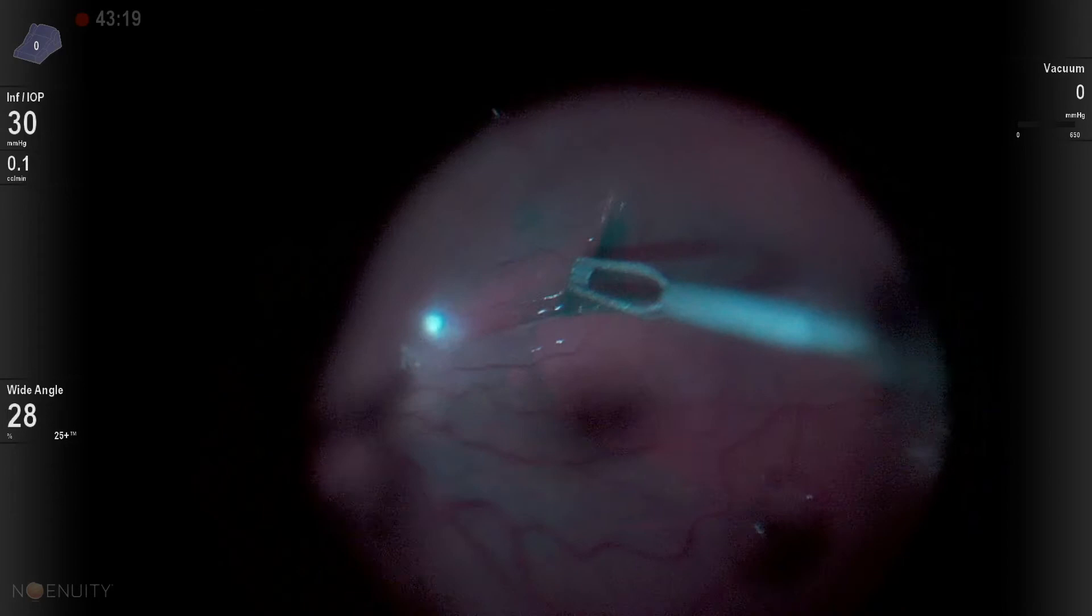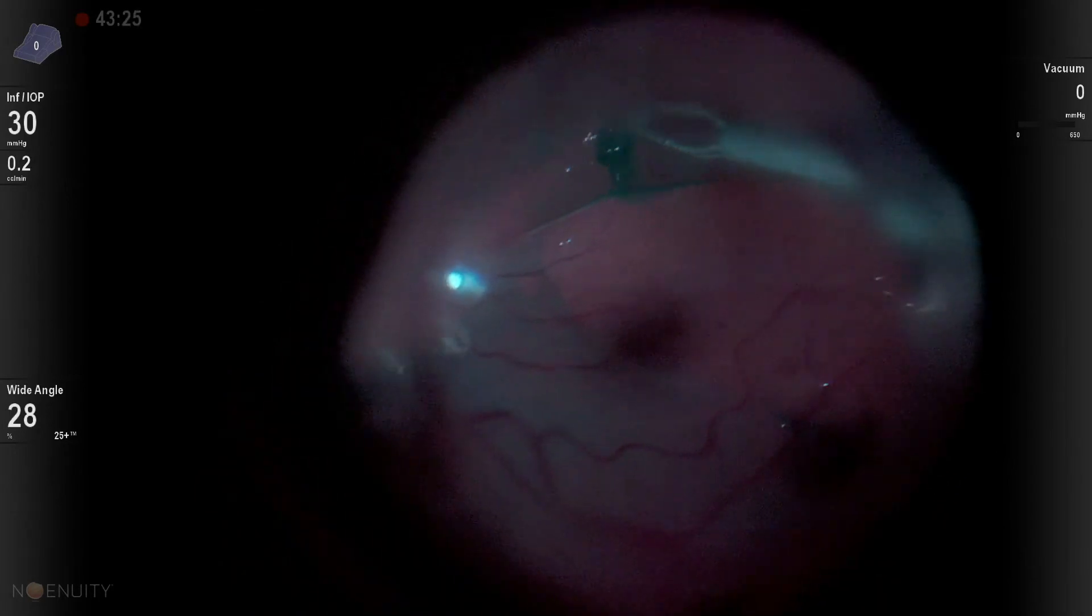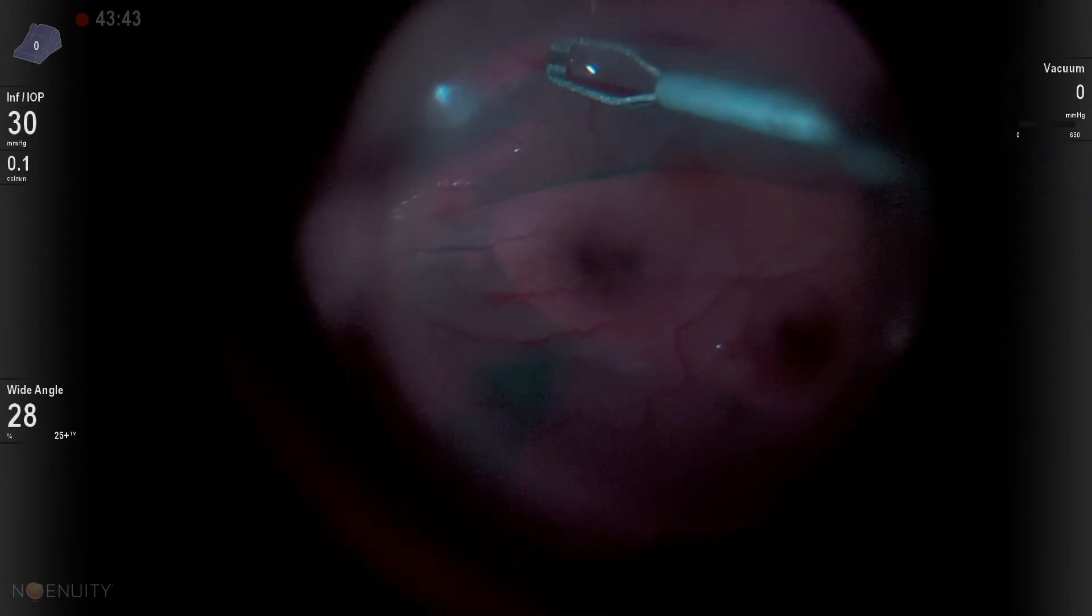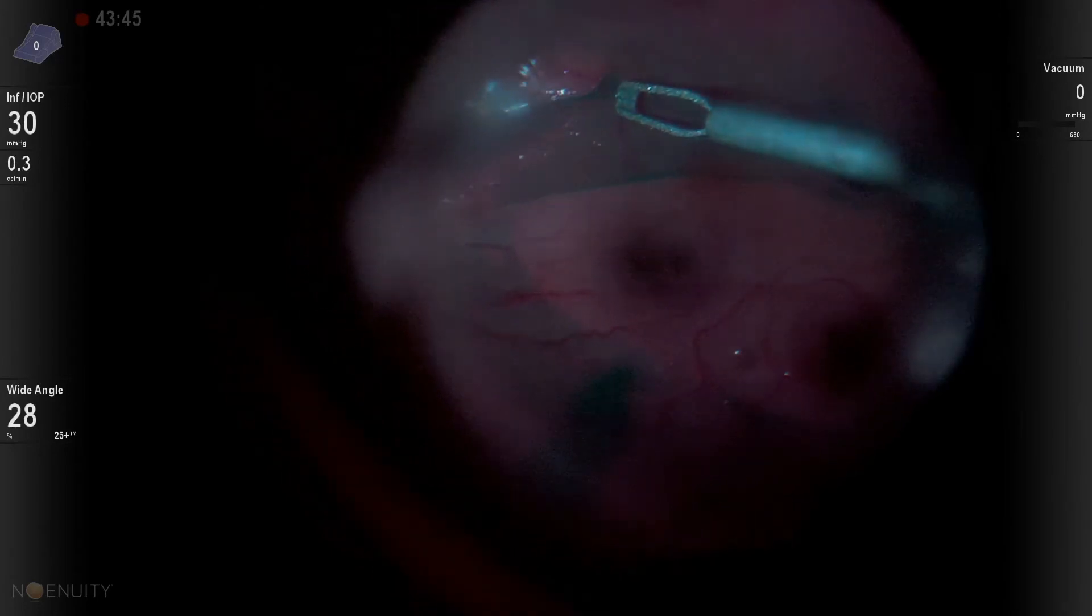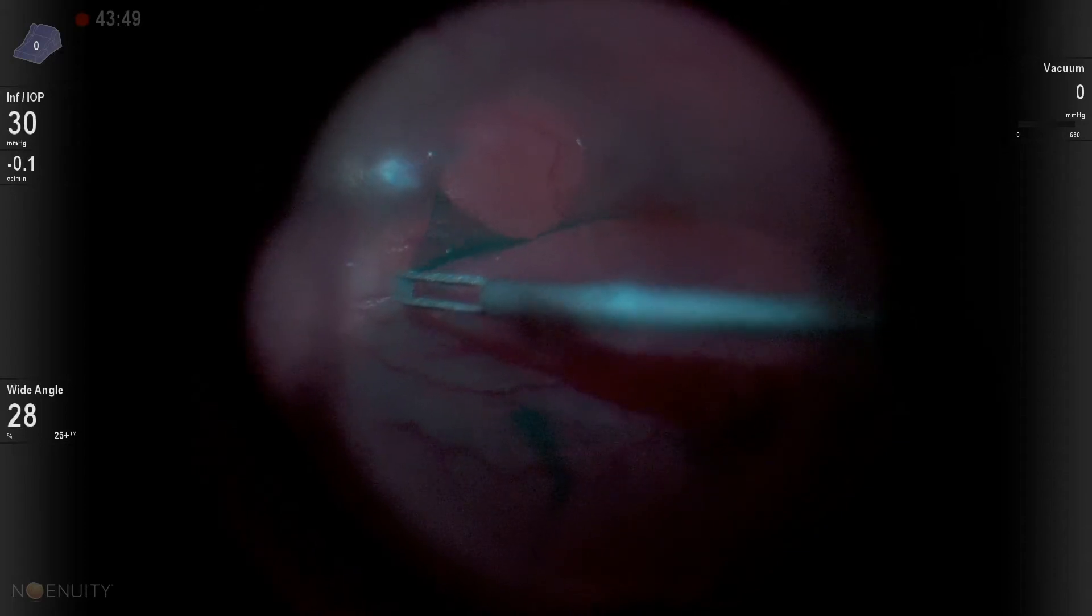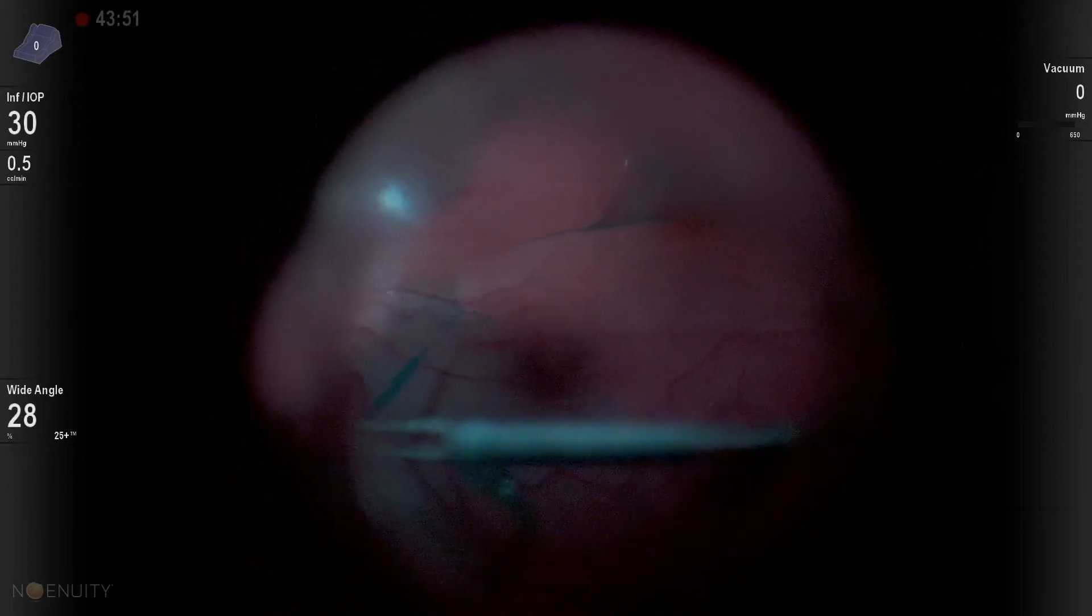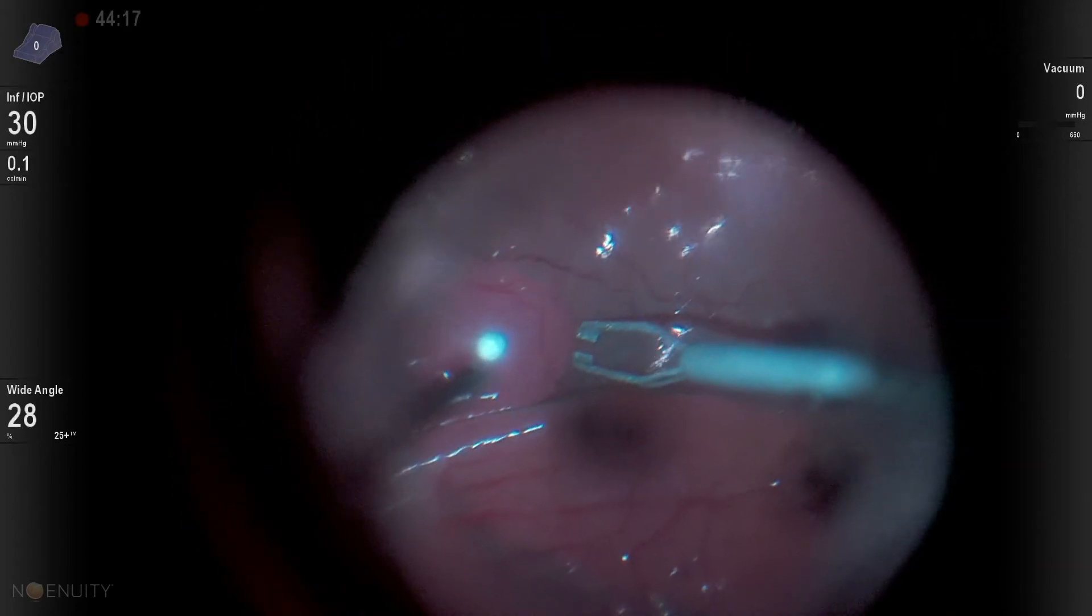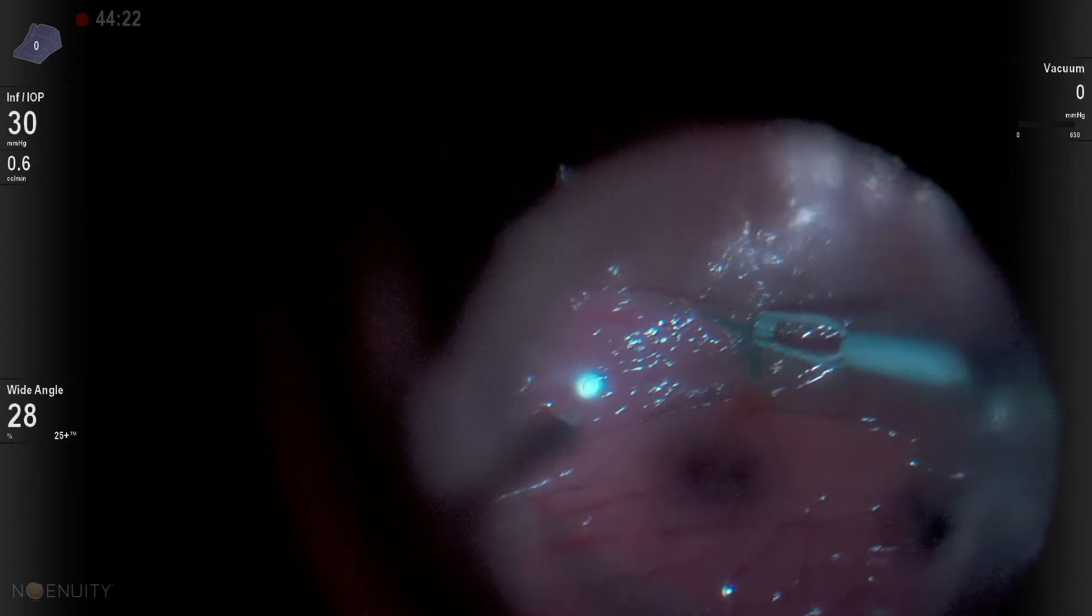This is, by the way, sped up to two times the normal speed. But to keep that ILM folded back over on itself and to continue to drag it in the plane of the retina underneath the PFO. And the nice thing about peeling under PFO is that you can get some extremely, extremely large and broad peels. And so it really does an unbelievably beautiful job.